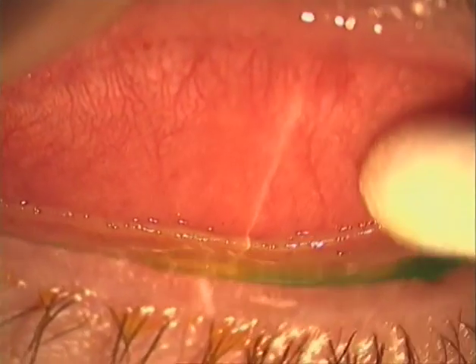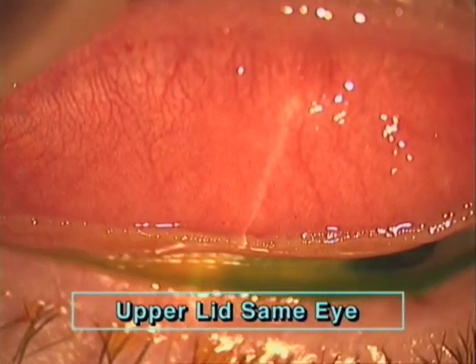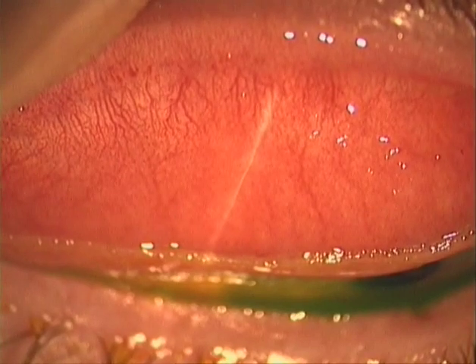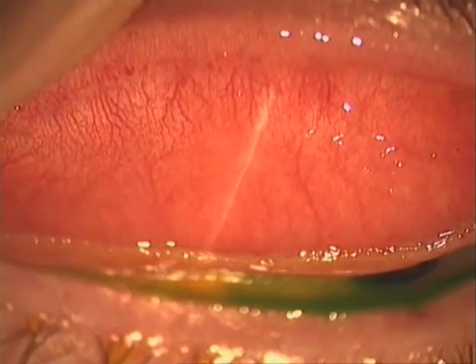There are no vessels inside the homogeneous mass, but there are vessels arriving from the outside to the mass, which are very superficial. Because in the confluent follicles the capillaries do not form a corona, only their superficial position allows the diagnosis of follicular tissue. In the upper lid of the same eye, after removal of a layer of fibrin, we find the large tarsal vessels partially hidden by a pinkish stratum in which we see focal areas of a whitish tinge.